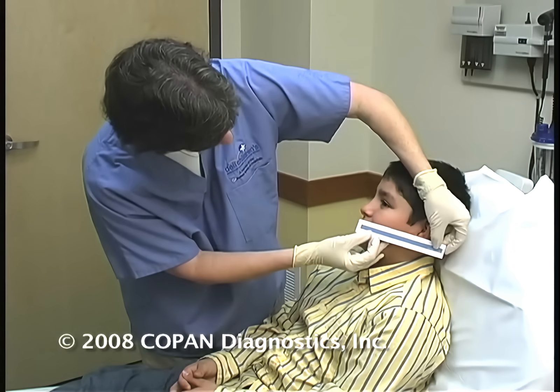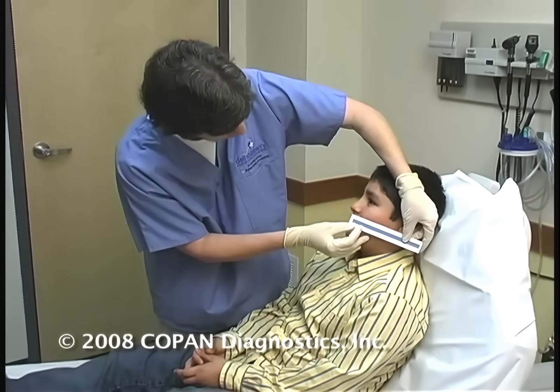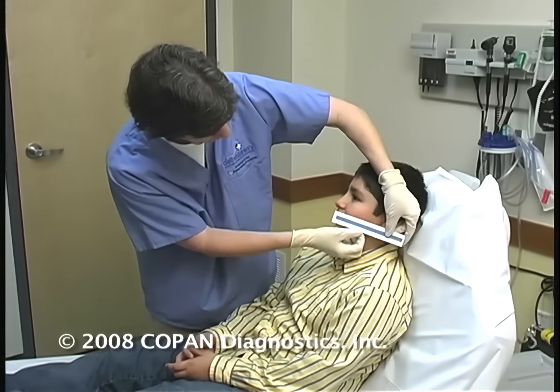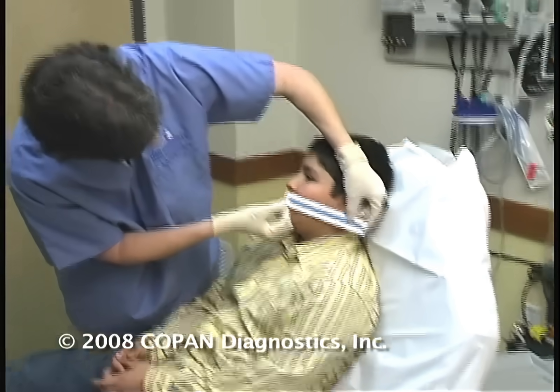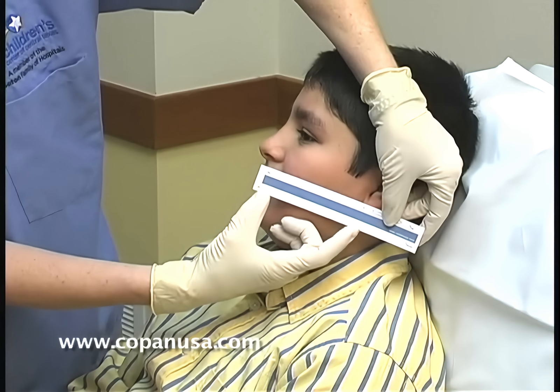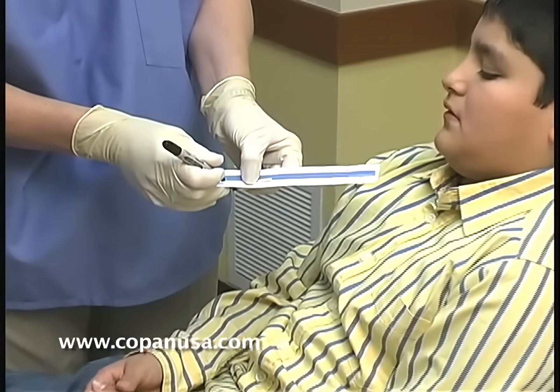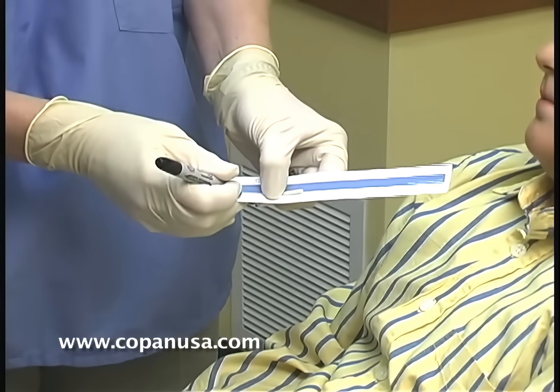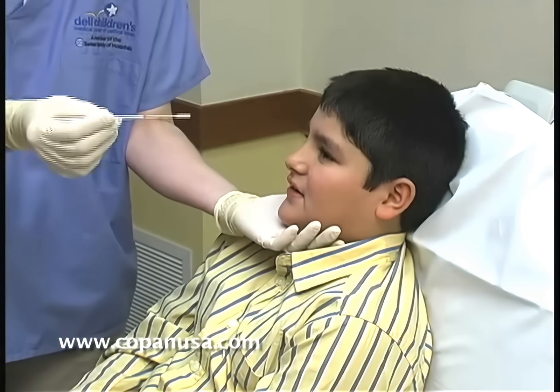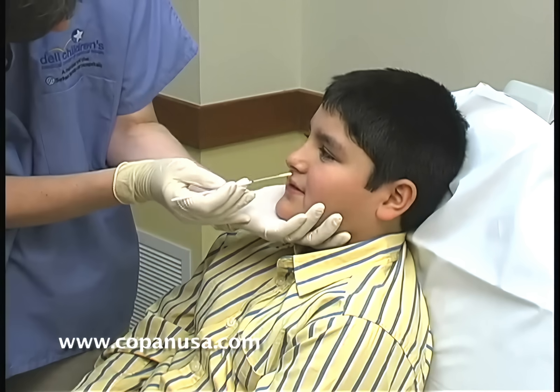When you are getting ready to do a swab, it's often easy and nice if you take a measurement so that you can see the correct length to go. What you would do is use a disposable ruler, which is provided by Copan, to measure from the base of the nose to the earlobe. In this case, you can see this young man has approximately four inches. You would mark the total length from earlobe to base of the nose, then use half that distance to mark your swab using a pen such as a Sharpie, so you have the exact distance to use.